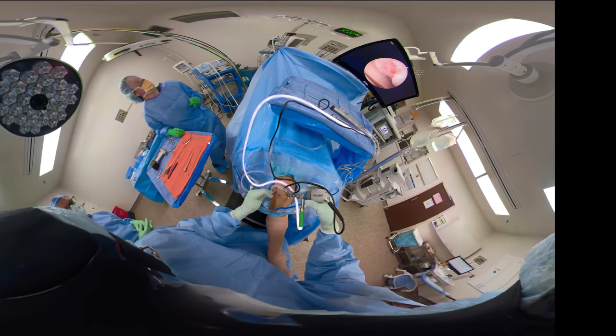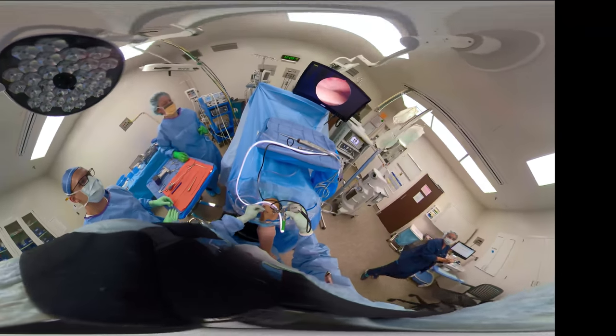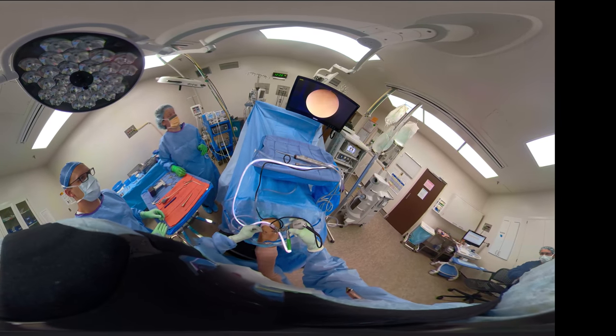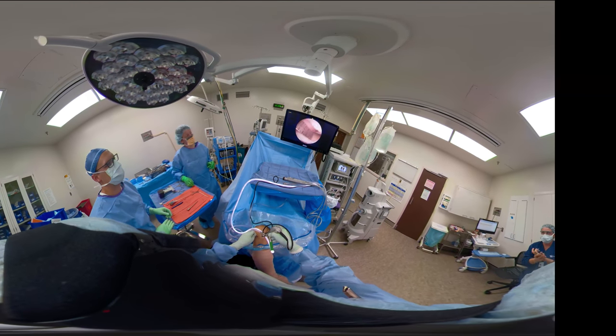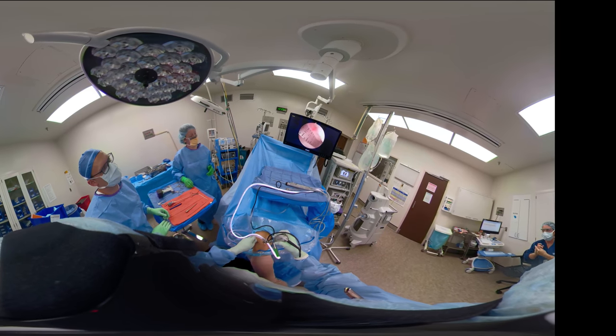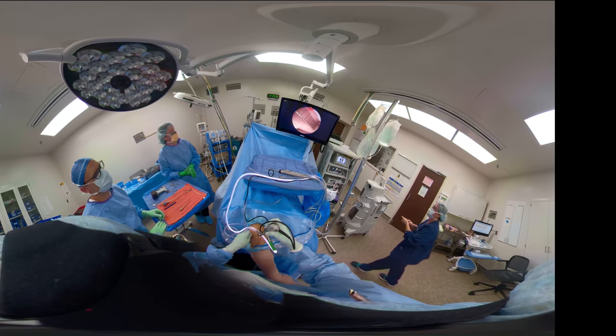You can see I've got the knee in about 90 degrees of flexion, putting a spinal needle in to triangulate this. I usually hold the spinal needle more toward the back of the needle. You can see where we're a little flat there, so we're going to come a little bit further down, measuring the size again of this defect when we've got the scope medial, working portal lateral.